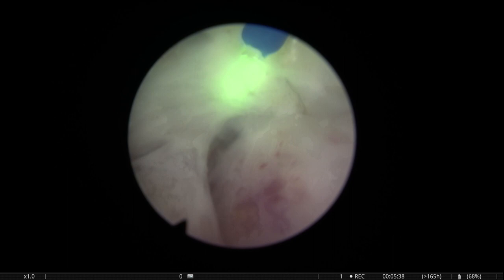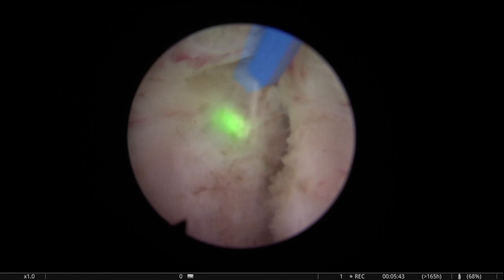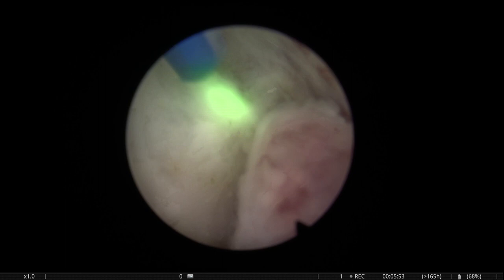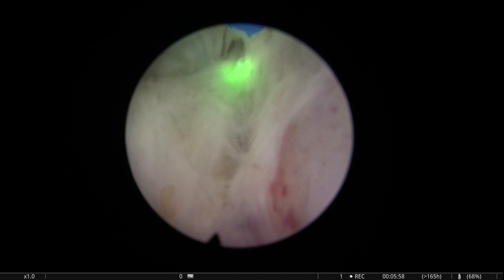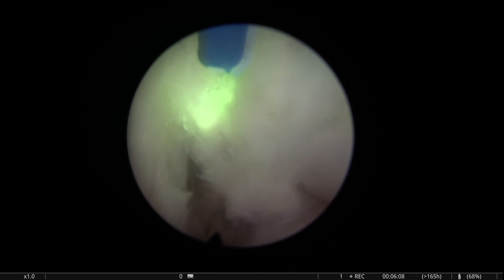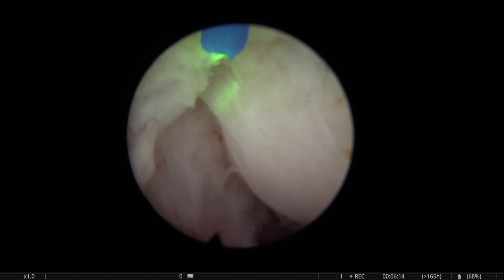This is an apical nodule. It's very interesting that sometimes when you find such an apical nodule, you tend to find it also on the other side. So for some reason, these nodules are symmetric. And I'm thinking embryological causes here, that the formation of the prostate is genetically determined, and it's a very complex process. But I'm thinking that clinically we find that often these nodules are found on the other side also.